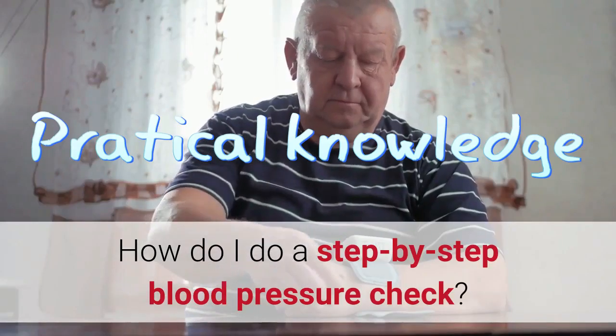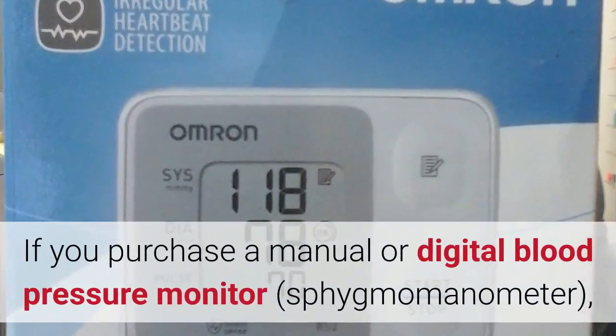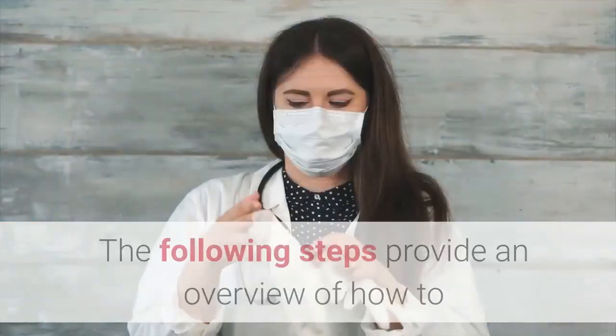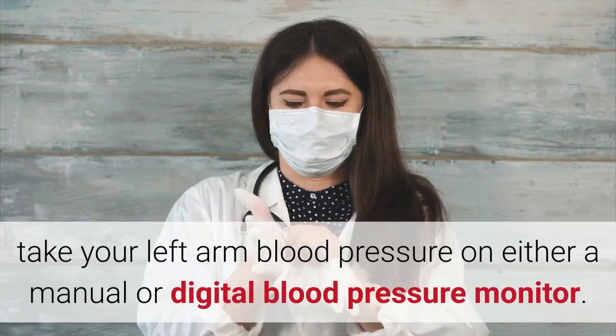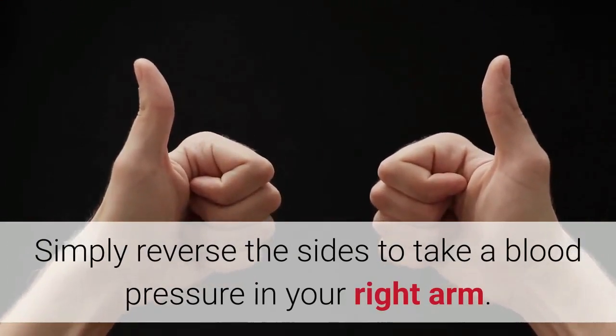How do I do a step-by-step blood pressure check? If you purchase a manual or digital blood pressure monitor — sphygmomanometer — follow the instruction booklet carefully. The following steps provide an overview of how to take your left arm blood pressure on either a manual or digital blood pressure monitor. Simply reverse the sides to take a blood pressure in your right arm.